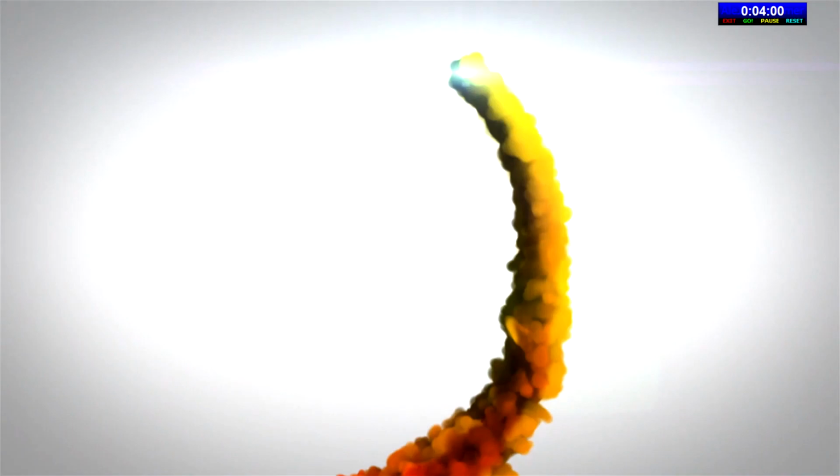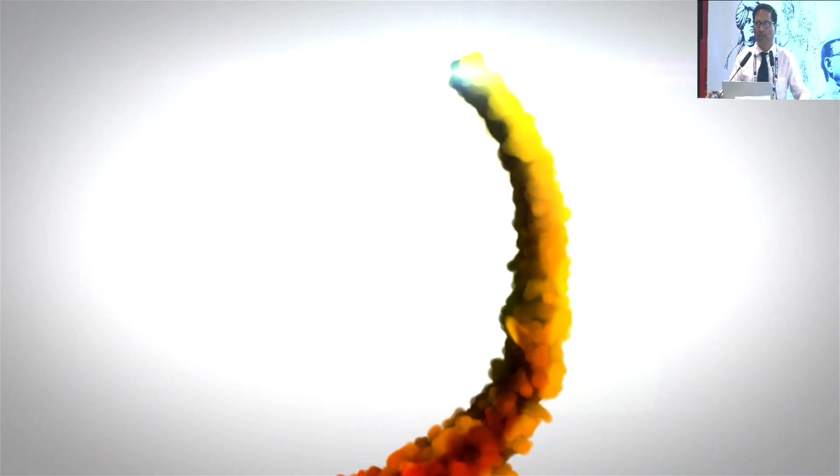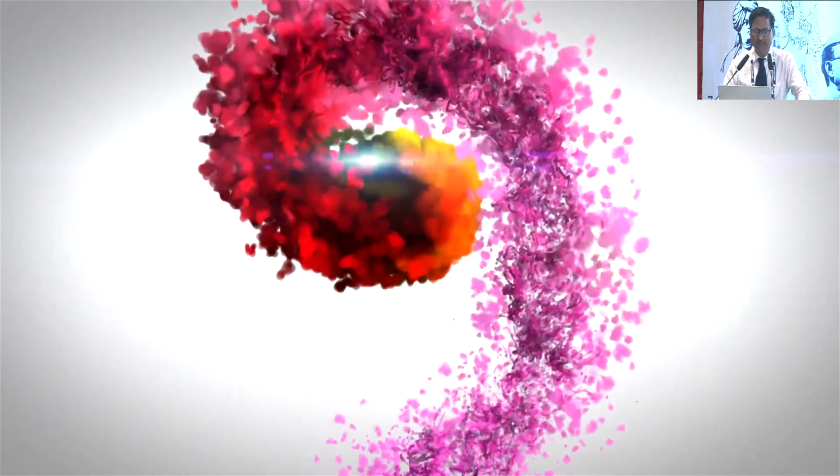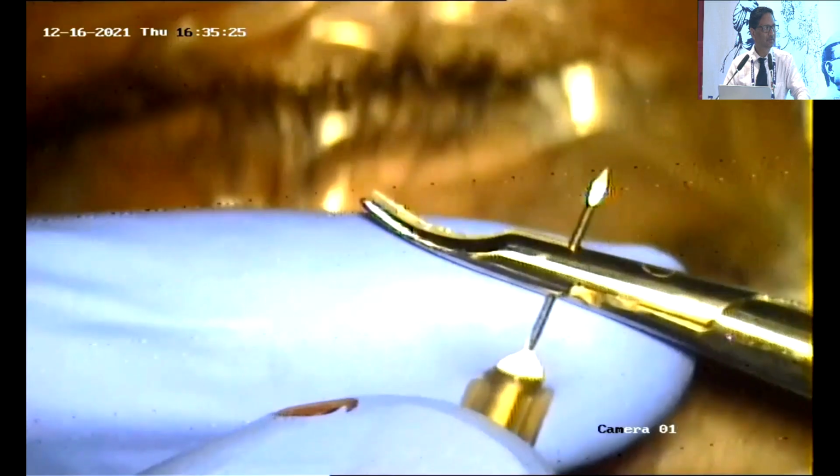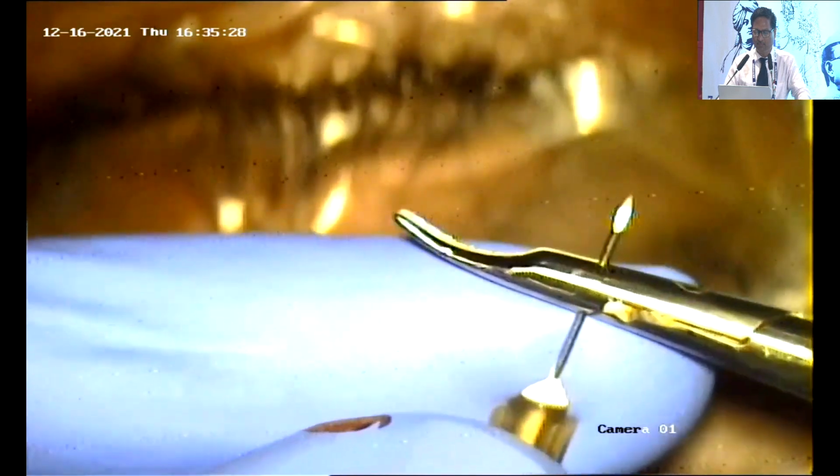Okay, you get it. So respected chairman, co-chairman, moderator and judges, very good morning to one and all. I am going to present a video with voice on. Please play the video. It's a very innovative technique of OT fluid gas exchange, or fluid air exchange we can call. Technique of OPD FGE that I call as OT FGE.